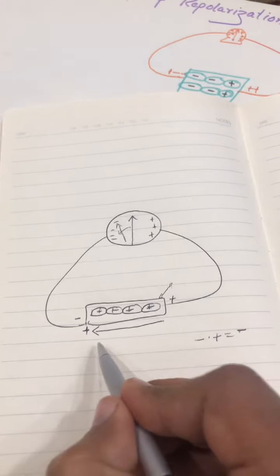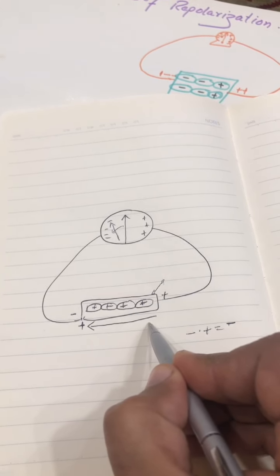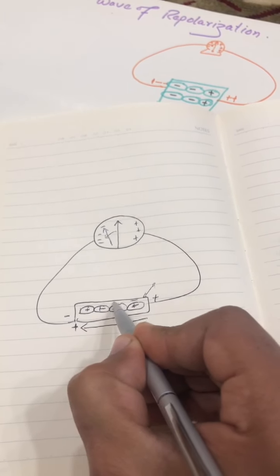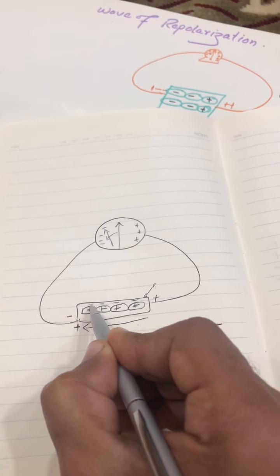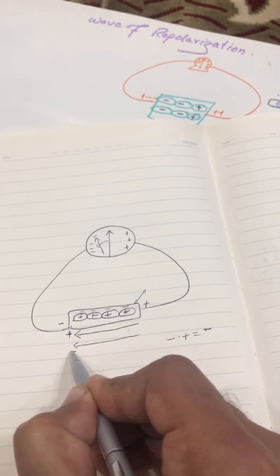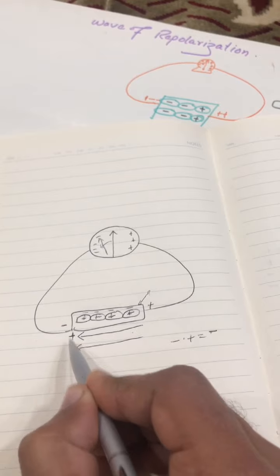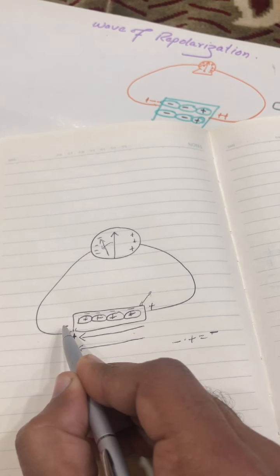Now see, the wave of depolarization will be followed by the wave of repolarization. So repolarization will be occurring like this, see. Now the arrow of repolarization, see, this is a negative wave, is going toward the negative electrode of the galvanometer.